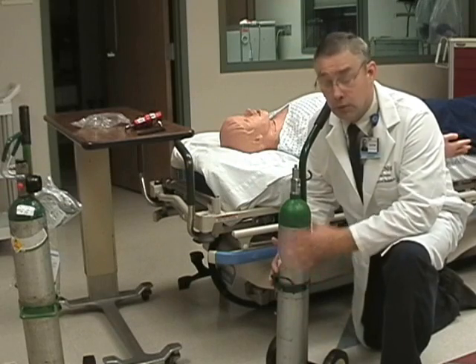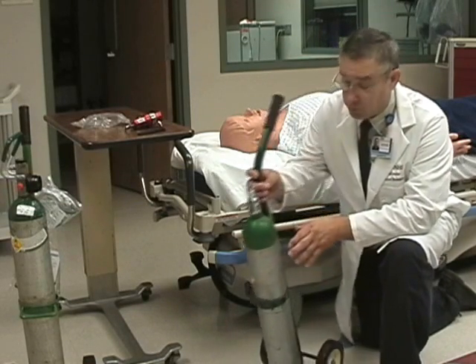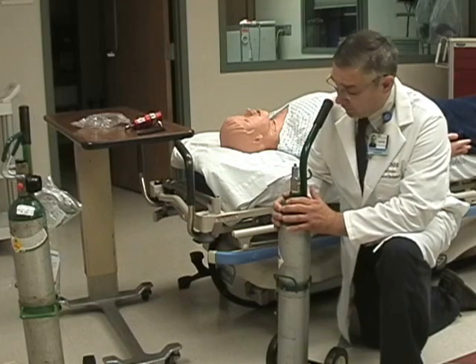The cart will protect the tank from damage if the tank should fall over. It's not complete protection, but it will do a fairly good job.